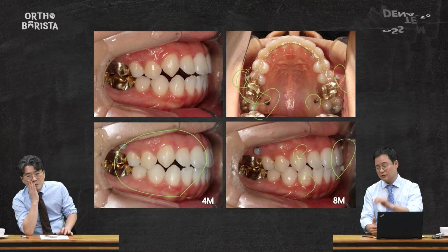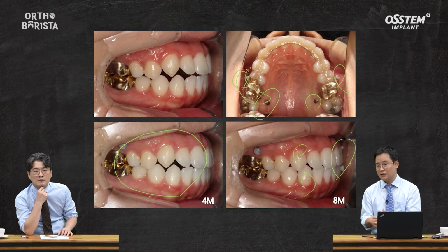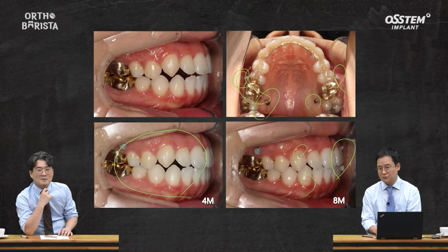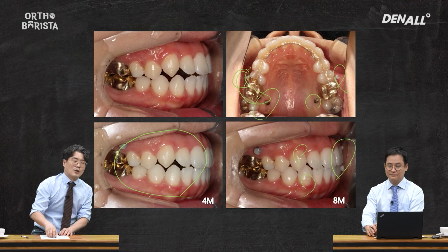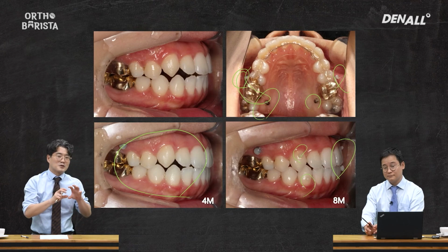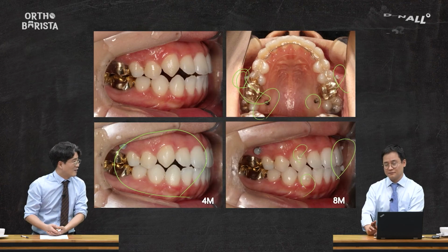Right. Actually, this patient had a relapse before. She suffered a relapse after having gone through all the difficult open bite treatment. She didn't want to have brackets. So, I chose this approach, and this is currently in the retention phase. It has been 6 months now since the treatment was finished. So far, retention looks good. By using screws like this, unlike in bracket-based treatment, we can distribute the forces through aligners. I think that is a very good idea. Yes, that's right.